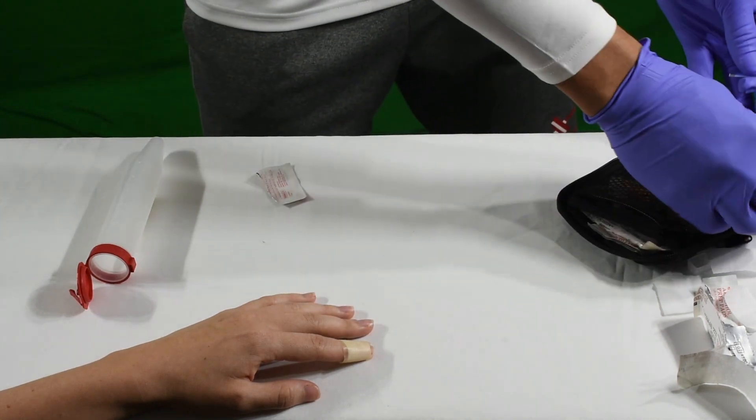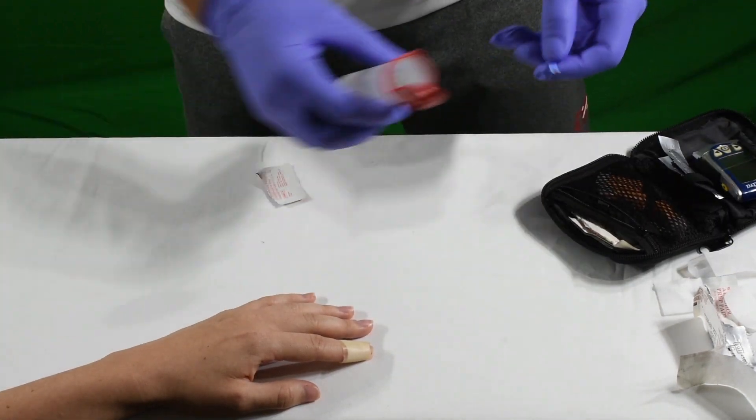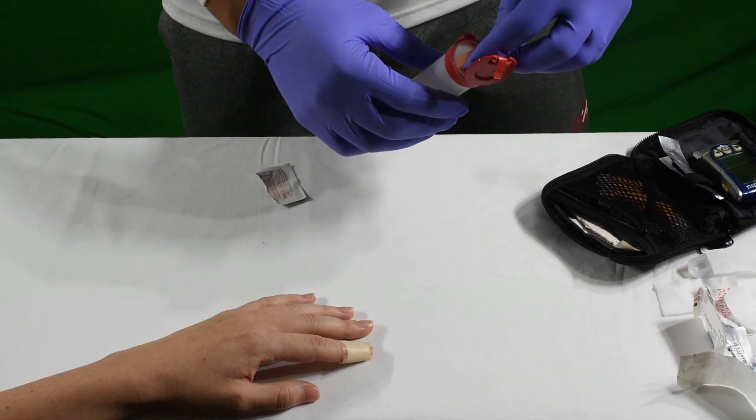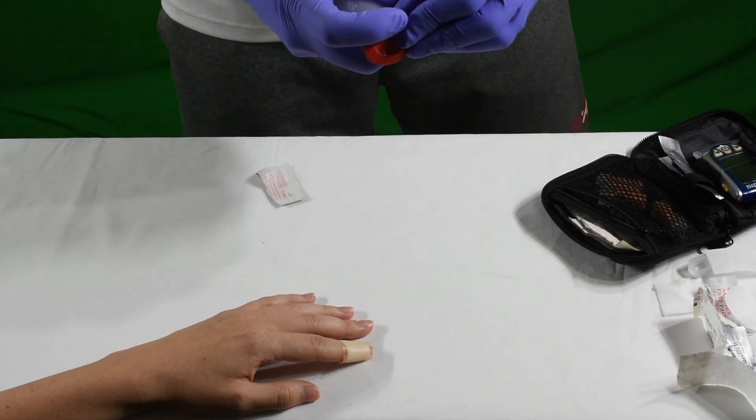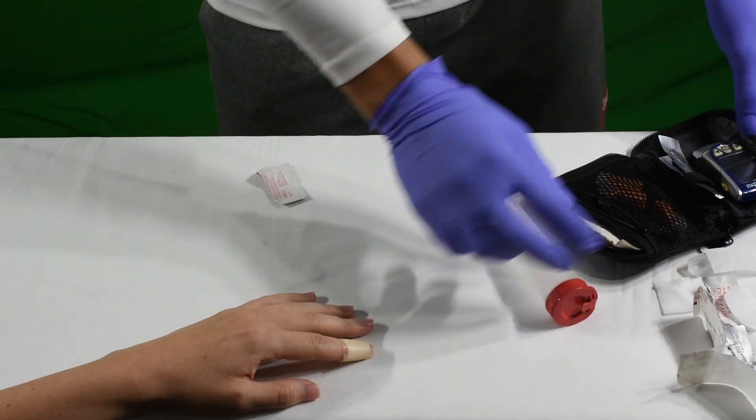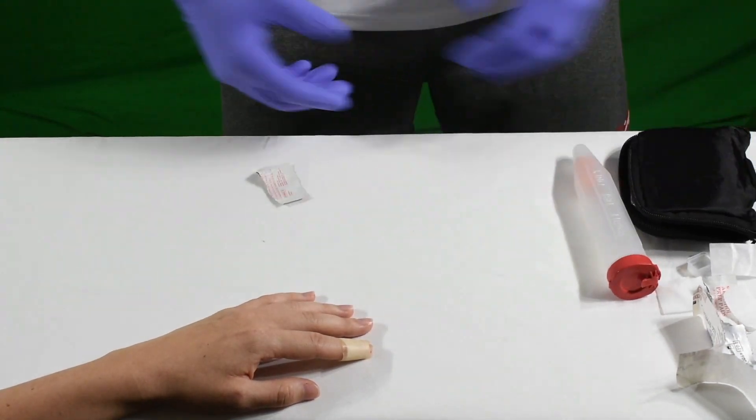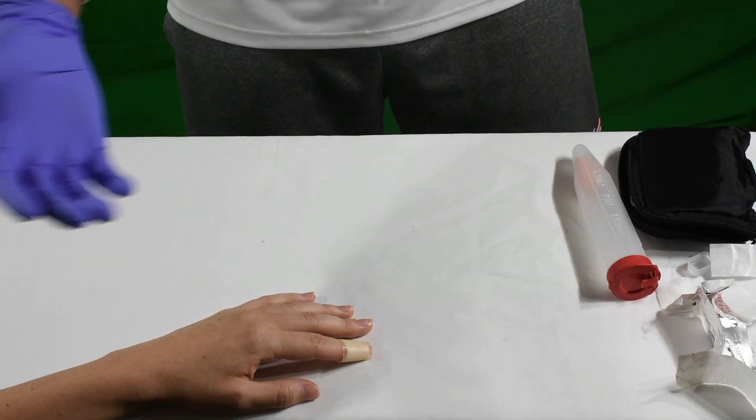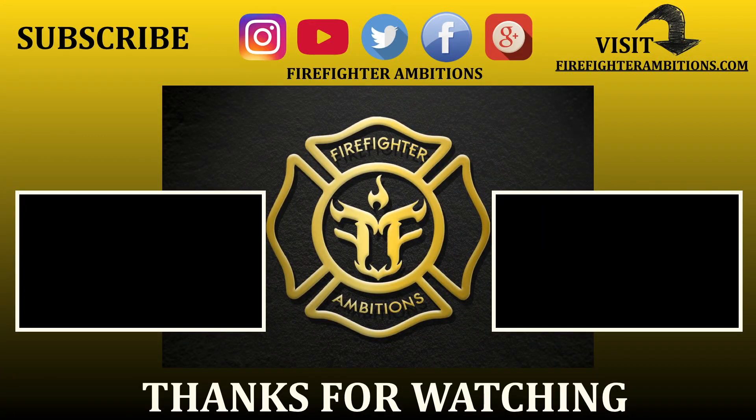Once you've got that reading, you want to document it in your patient care report and dispose of the sharps and blood into your sharps container, ensuring that you secure it. Then you assess the need for your patient when it comes to medical intervention.